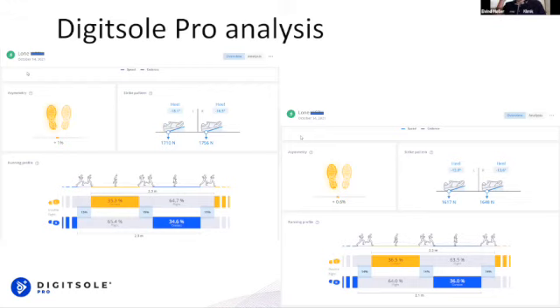When we put her into the Altra, an Altra Paradigm 6, we gave it to her without any instruction. We just said, could you please try and walk and do the same run in these shoes. We immediately altered 4 degrees of her heel strike angle when she ran in them. Of course, this is an immediate impact as she just tries them, so it's a bit biased on this new shoe. But by changing only the shoe to a more progressive shoe in regard to drop, we could alter the dynamics of how she was attacking the ground. That was for me the first thing where you can say, okay, here is something we can maybe use as a tool to help her in some way.